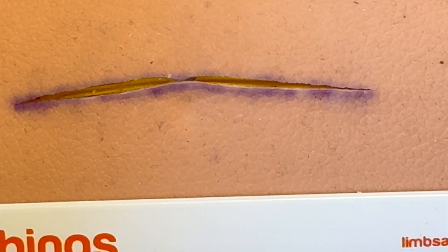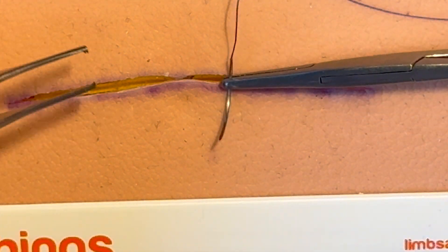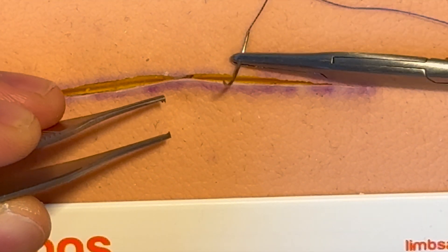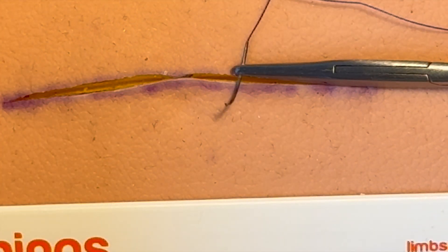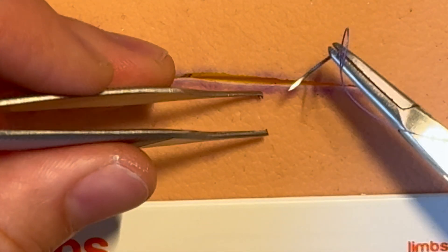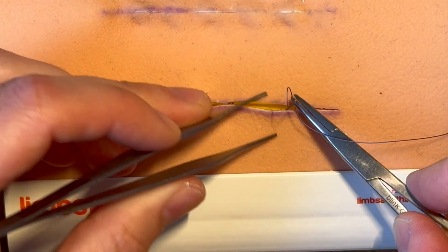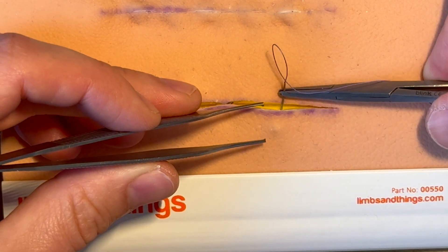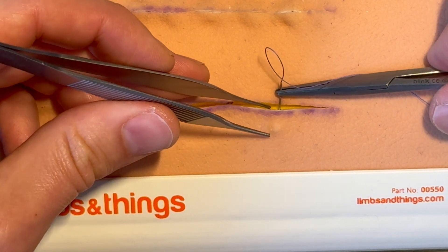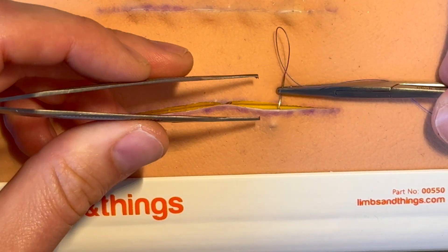What I tend to do is modify it a bit. Getting that angle to get a really nice dimple was quite hard, and it can pull through — that can happen in the human too. So instead of doing that, you go in halfway between that one and the end, pop it into the subcutaneous fat, get that dimple again, and instead of trying to come back on itself — although you can aid that by folding the skin over.